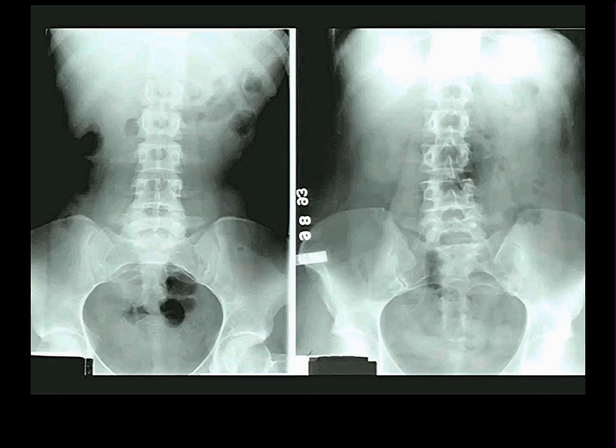All right. Start off as I do regularly with plain films. These are abdominal plain films of two separate individuals. And as you can judge, you can't see hardly anything. You can't see hardly anything on abdominal plain films because things are either water density and they all merge together, or there's a couple air bubbles because you always have air in your bowel. And depending upon how much air you have in it and what loops of bowel the air is in determines what you can see.